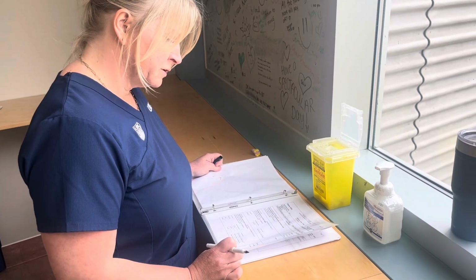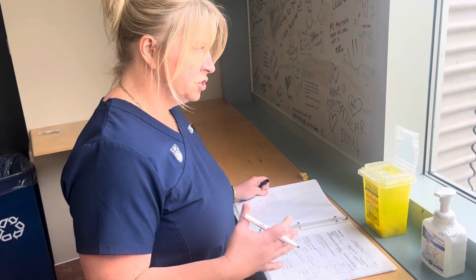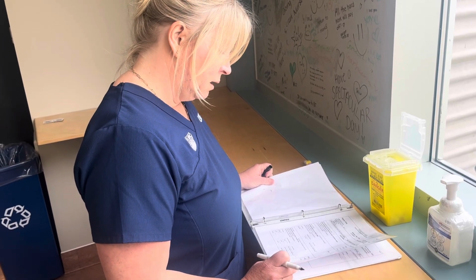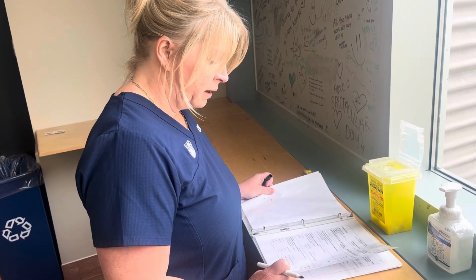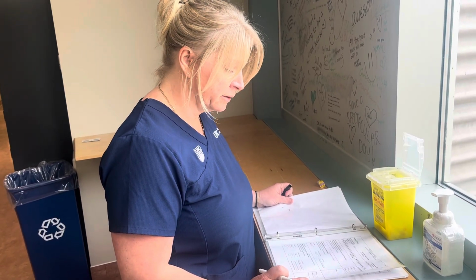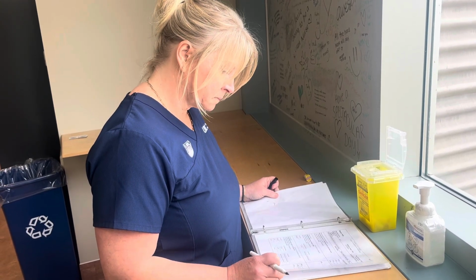The main adverse effect we need to be concerned with is hypoglycemia, which would be indicated by jitters, sweating, general unwell feeling. And one of the main nursing considerations is making sure that she is taking it with food. I will teach the patient about the importance of that when I administer it.